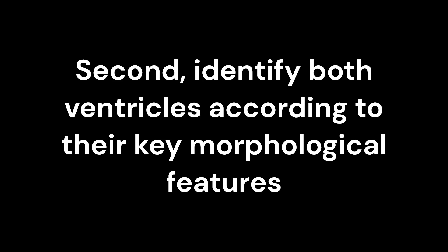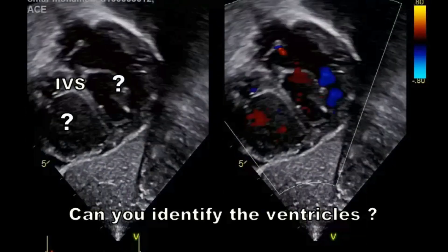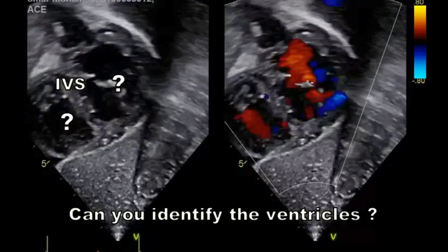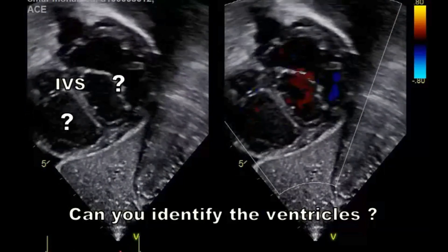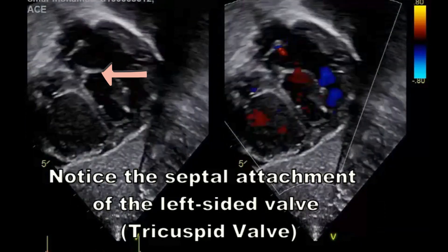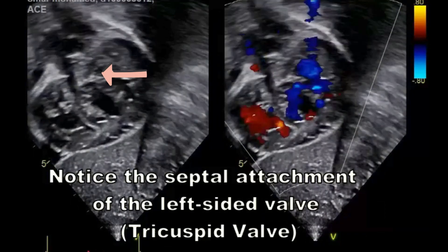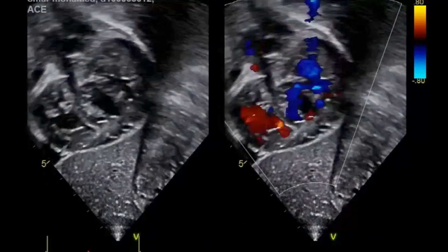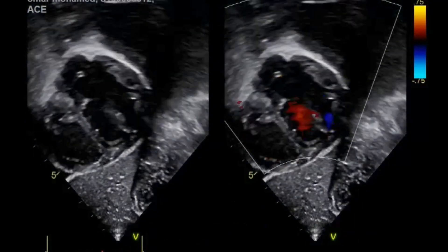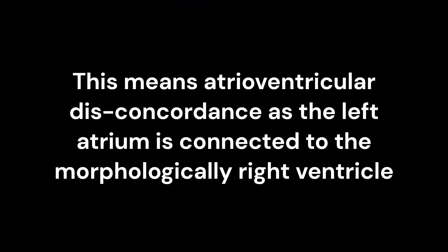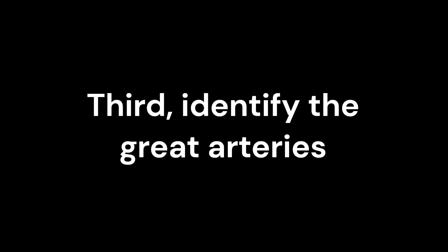Second, identify both ventricles according to their key morphological features. Notice the septal attachment of the left-sided valve — this identifies it as the tricuspid valve. This means atrioventricular discordance, as the left atrium is connected to the morphologically right ventricle.